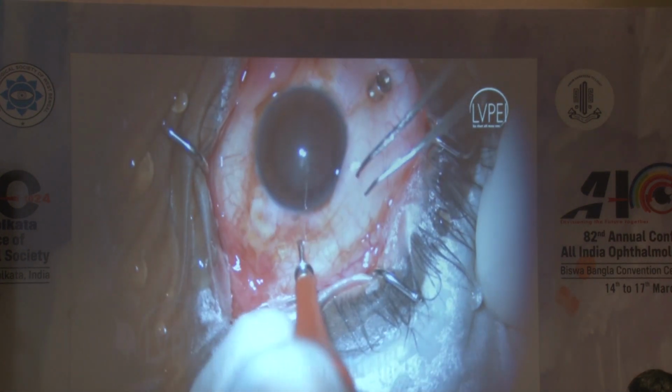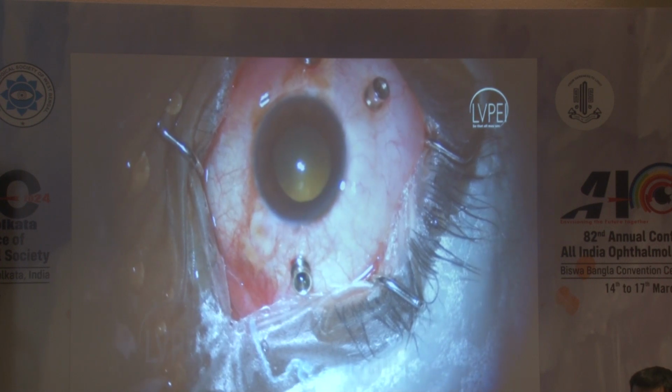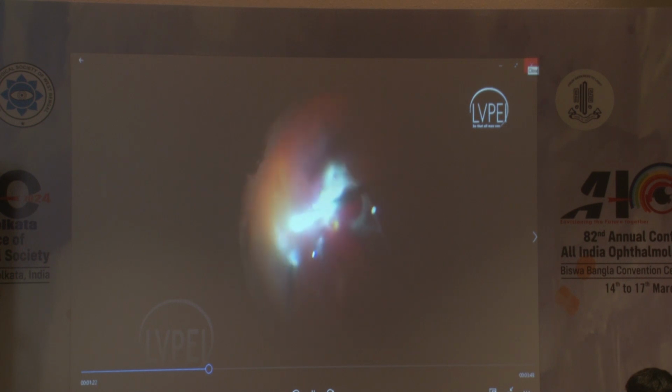The sclerotomy ports were made 3.5 mm away from the limbus, followed by which anterior vitrectomy and core vitrectomy were done. Truncation of the cone was done in all the quadrants to separate anterior vitreous from the posterior vitreous. Vitrectomy was done over the fibrous proliferation to release vitreous traction over it.